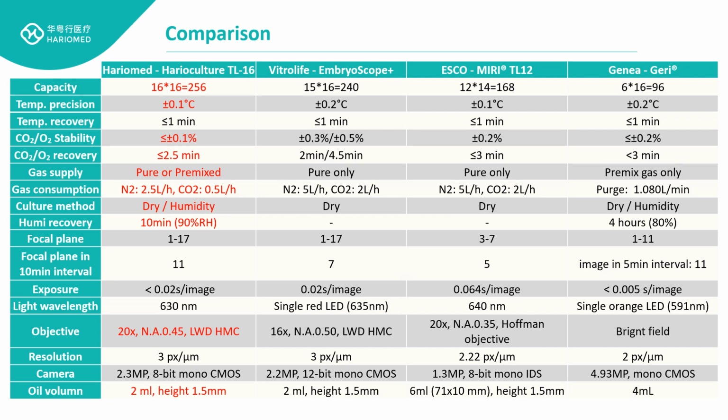And for the default setting, the exposure time for one picture will be less than 0.02 seconds. And with the unique design of our petri dish, the oil volume will be 2 ml with a height of 1.5 millimeters.